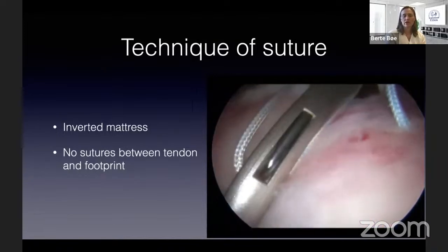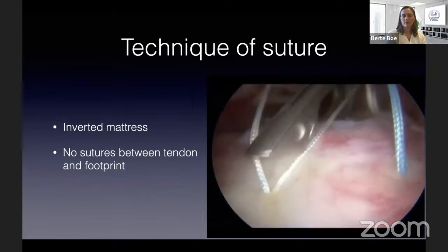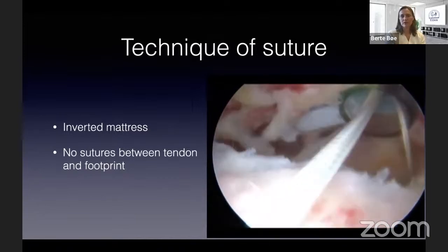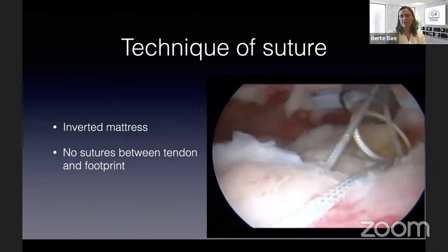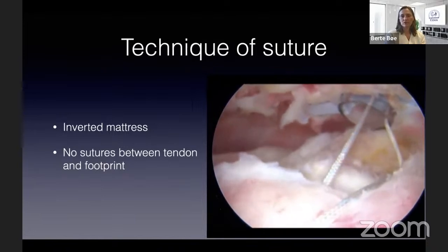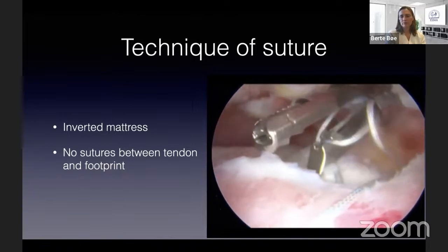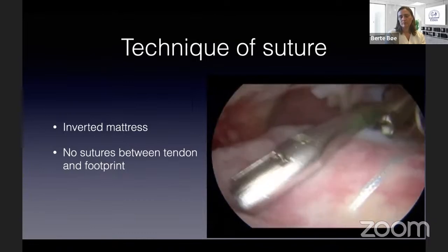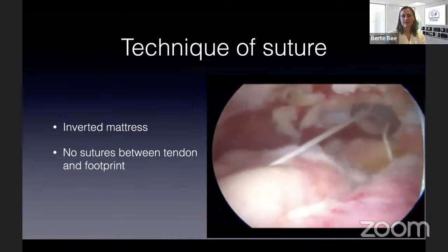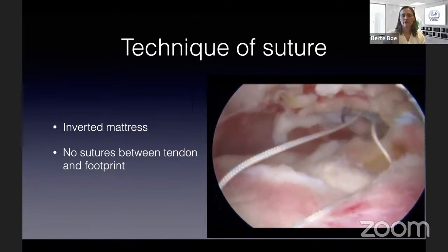You saw that I turned the suturing device 180 degrees around, shooting from the superior part of the supraspinatus or infraspinatus with the first stitch. And then you take the suturing device all the way out again, and you reload it with the same suture. And when it comes back in, you do a suture the other way. In this way, you will have no suture between your tendon and the bone. So theoretically, that will be good for healing, that you can now tie these two ends and you have no sutures between the tendon and the bone, and you kind of compress the tissue down to the footprint when you tie the knots.